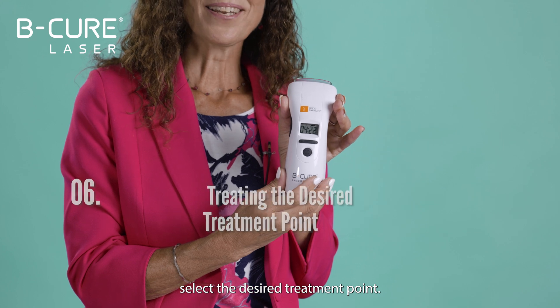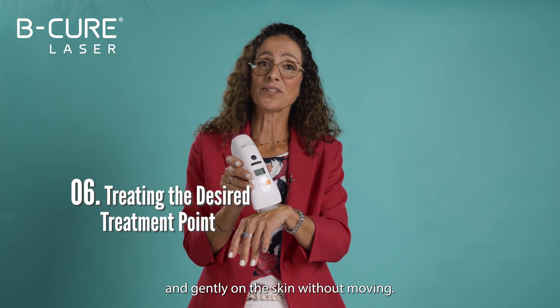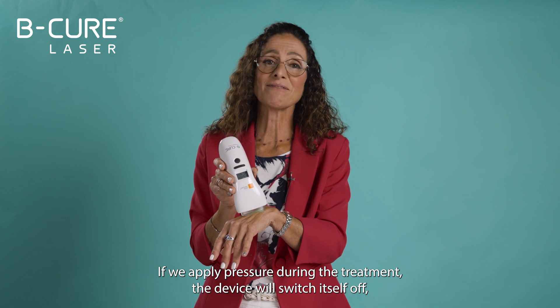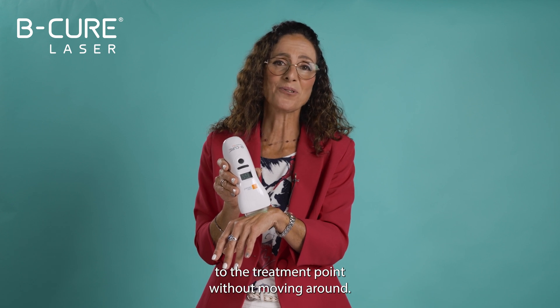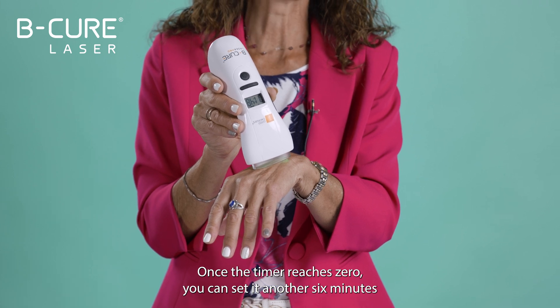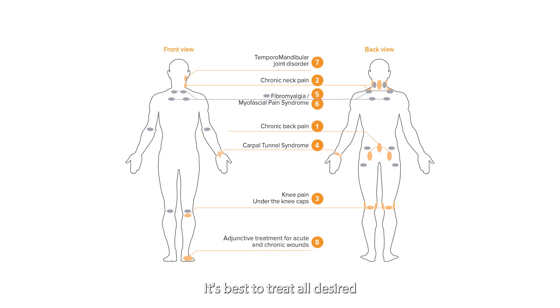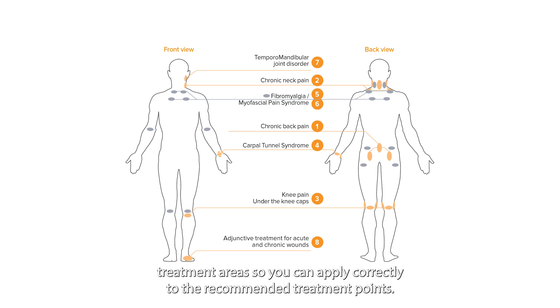You need to select the desired treatment point. Here I'm placing the BeCure Laser directly and gently on the skin without moving. If we apply pressure during the treatment, the device will switch itself off. So it's important to hold it lightly at a perpendicular angle to the treatment point without moving around. Once the timer reaches zero, you can set it another six minutes and start the treatment at the same point in the same way. It's best to treat all desired treatment points at least twice a day. You should have received a brochure with your new device showing treatment areas so you can apply correctly to the recommended treatment points.